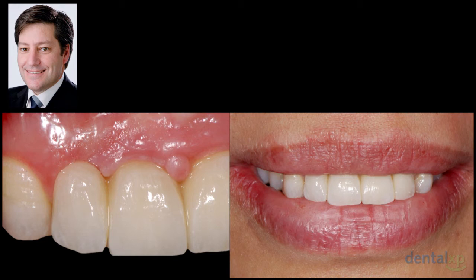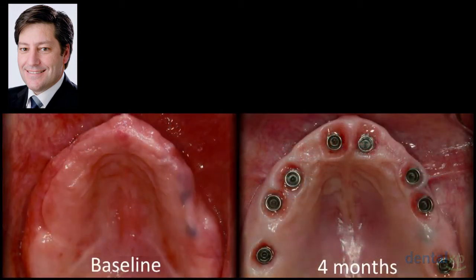I'm showing you a 1:1 ratio here. This is a very high magnification, and this patient already had a high value on the shading in this area. And you can see the levels here. This is where the papilla should be. This is where the interincisal papilla should be if the case was anatomically correct, but you will never get it down there, right? So that's why it's a small prosthetic trick that you can use.